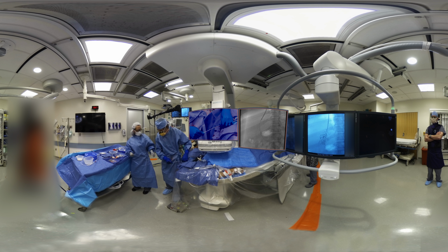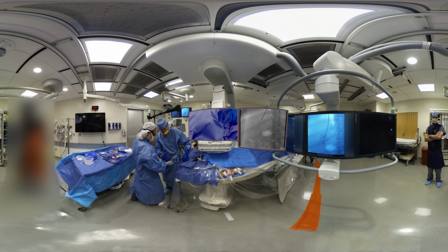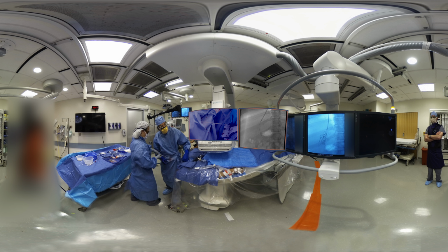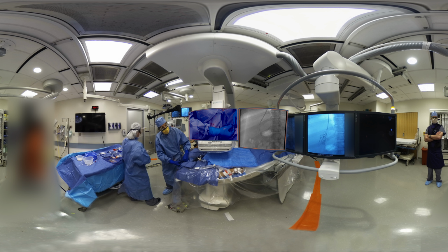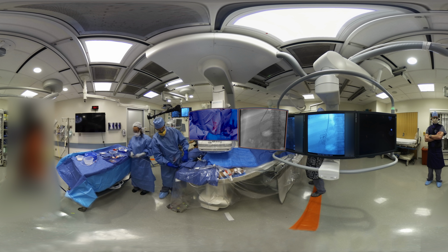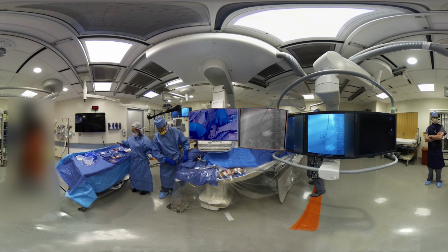Okay, can I ask you to back that out? Okay, but we've also assured ourselves that we can get that 5 French catheter across. Go ahead. No reason to give up access to the splenic vein. Great. I've got the wire pinched against the hub and around my fingers. Nothing worse than having a hydrophilic guide wire come out across your fingers.